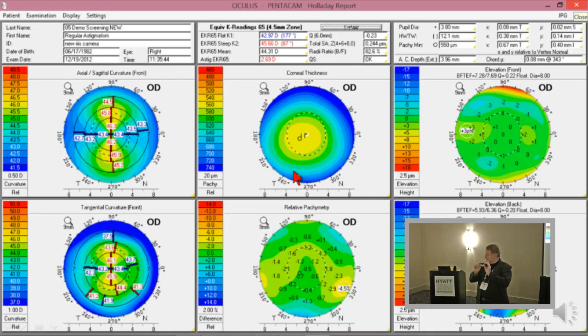It doesn't measure anything inside that ring or anything outside of that ring. Okay, so it's a ring. Now, on the Scheimpflug, on the Pentacam, when we take a measurement, it actually takes thousands of points, fits a surface, and calculates the best three-dimensional fit, and then calculates what the best radius to estimate that would be. So it looks at a zone.